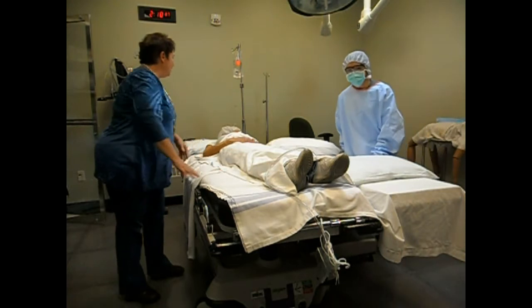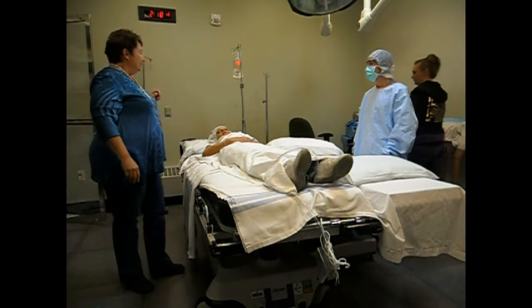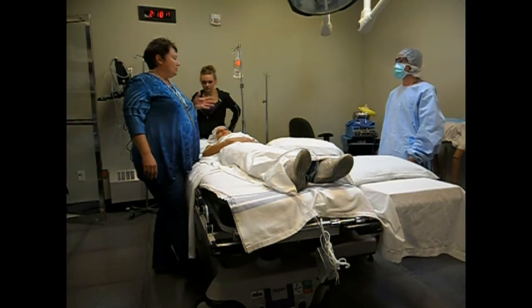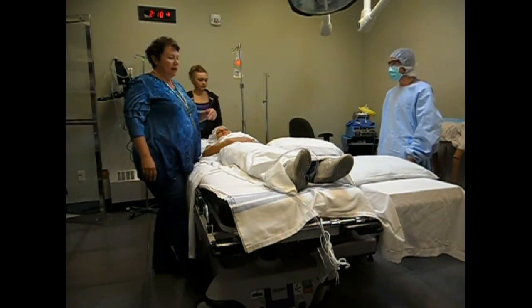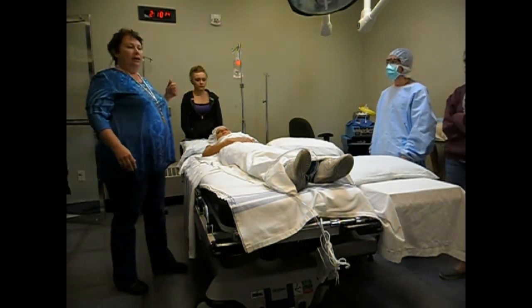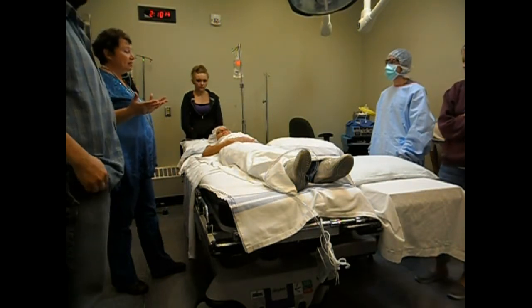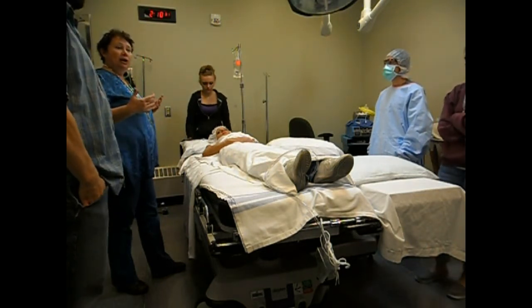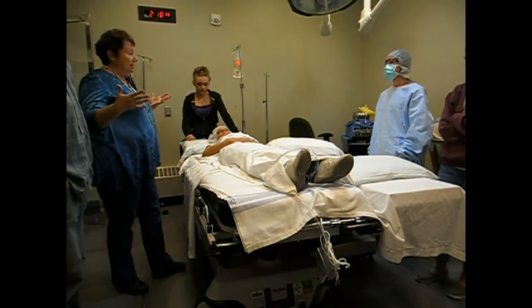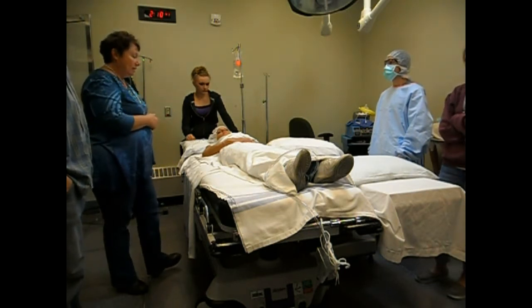And Randy, I'm going to have you be my anesthetist today. Ideally, a supine to prone would require six people, two on one side, two on the other, one at the feet, and then anesthesia at the head. The prone position can be used for a number of procedures. We can do a laminectomy procedure. We could do something on the thigh. We could do something in the buttocks, anus procedure, Achilles tendon, a lot of different procedures in that position.